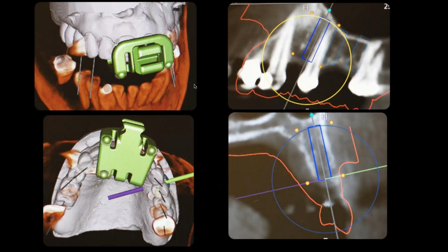And it's easy. So I took the plan, the models that they made of the setup, the lab imaged them, sent me, I could have done it with my scanner, but they didn't. So then they sent me the STL image. I superimposed that on the CAT scan, on the cone beam, and then I put implants in. As you see up here, this implant is not on the canine. It's actually a premolar. It's moved forward. So those are the kind of things you can see, and now you can line them right up where they have to come out. And you can see I have them lined up right where they're supposed to come out on both sides.